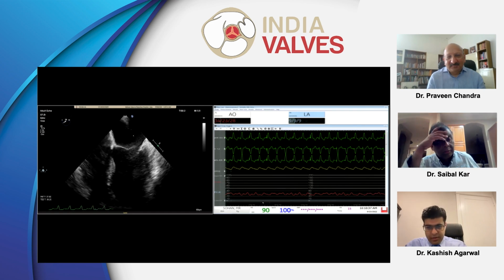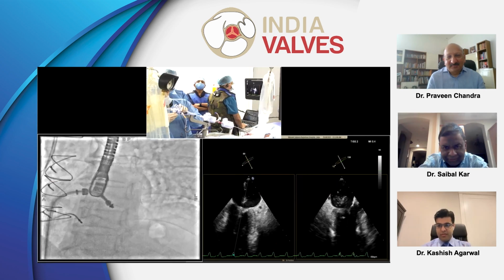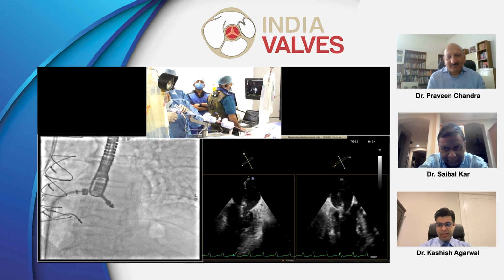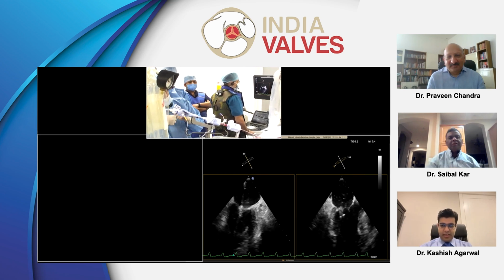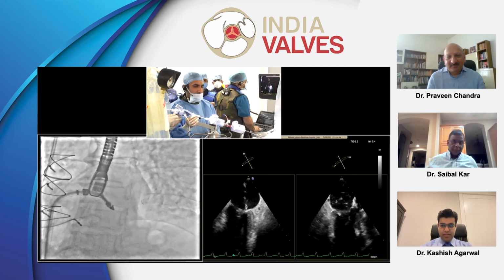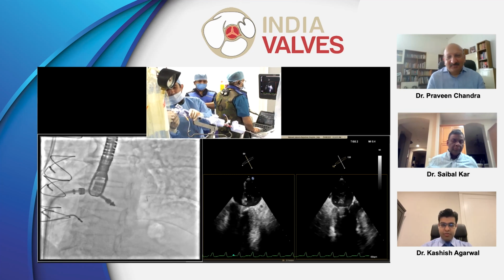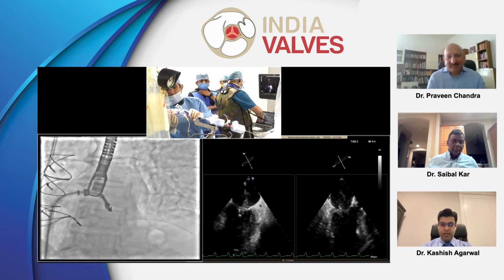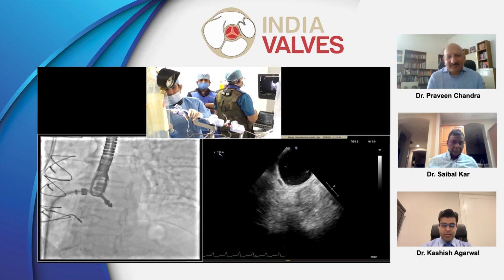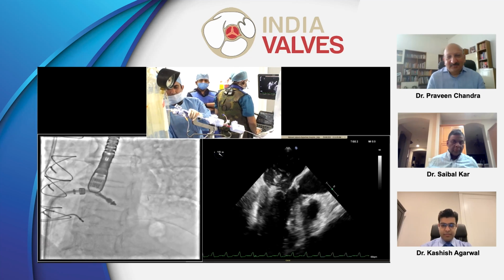Yeah, the LA pressure is like, the V wave is gone. This looks great. There are so many things we have to think about. With MitraClip, you need a TE. Can you do it or not, and what can you get? The other thing I would say in this case, one of the biggest things is to be careful about all the manipulations that were done in the left atrium to make sure the trajectory was right before you entered the LV. Because if you don't get that right and you had an aorta hugger, you would be struggling for hours, and you will get a bad result because the clip will be at an angle or something.